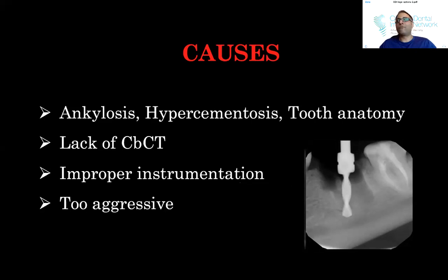Well, I did everything to try to take this root out. I couldn't get it out. The only way I could get this out was removing the septal bone. Well, guess what I needed to place the implant? The septal bone. So now the site is completely blown out. How do you manage that?